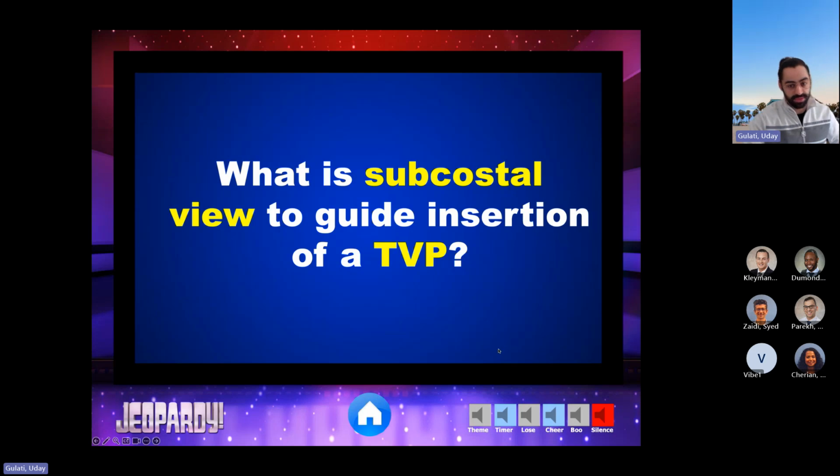So, right, a subcostal view to guide insertion of a TVP. You can use an apical 5 view as well, but usually if I'm having a resident do this, they're going to have an easier time finding the subcostal view. Plus that subcostal view just gives me a better view of the right ventricle in more novice hands.